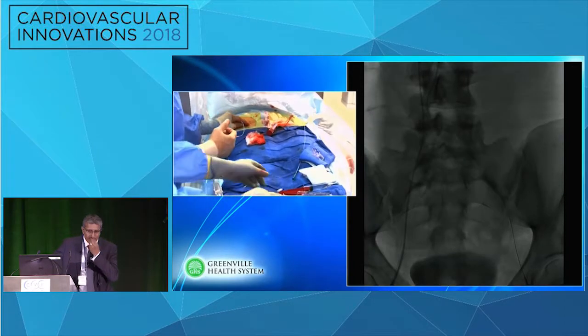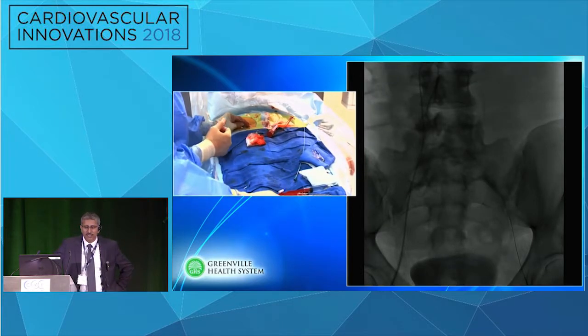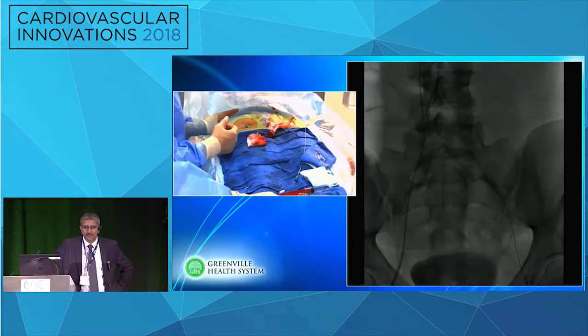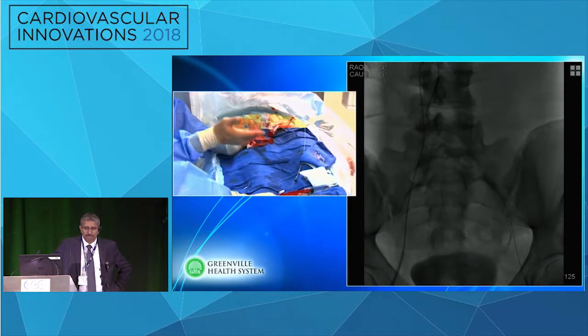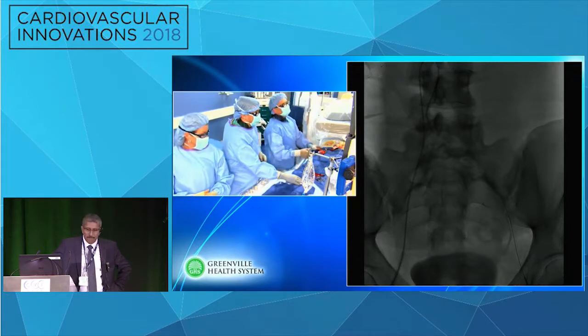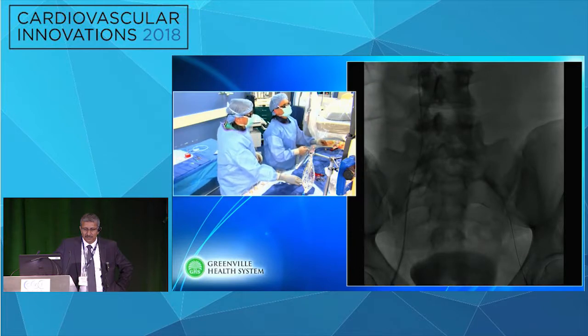Bruce, what is your guide wire you're using right now? That's just a straight stiff glide wire there. We had a Roadrunner. We've had an angled Advantage glide. And then I've tried, as you can see, the Sims comes down. It's hard to even see where it is.